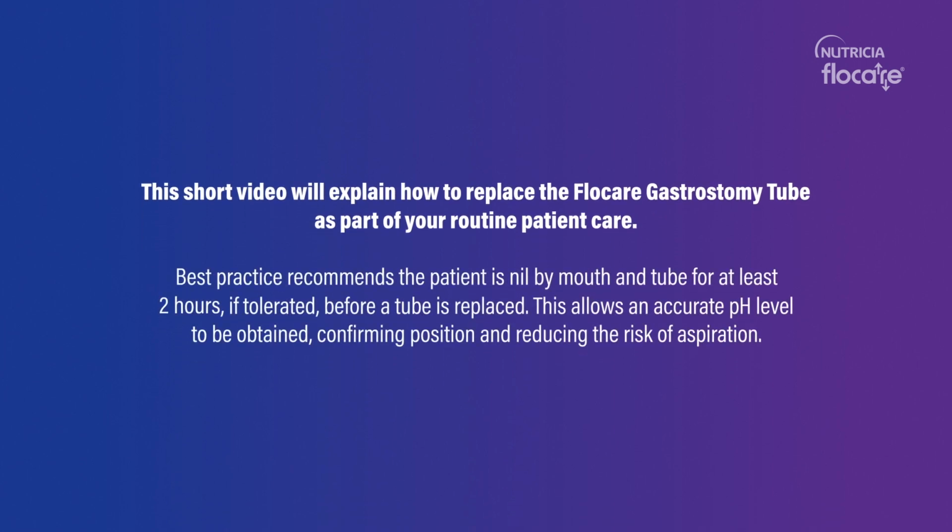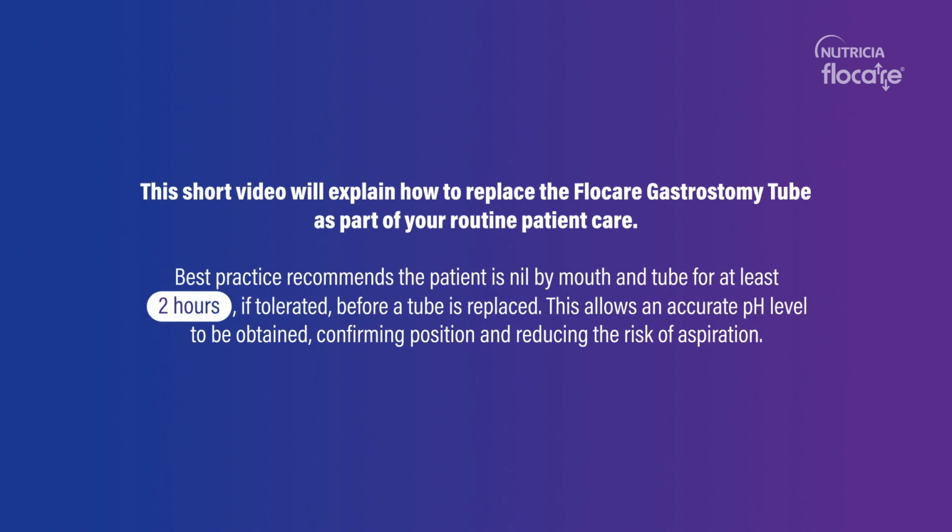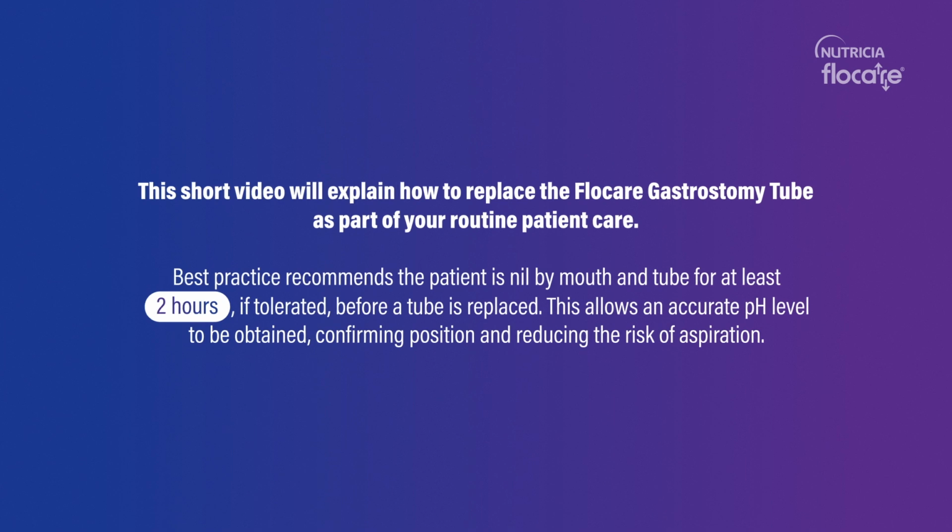Best practice recommends the patient is nil by mouth and tube feed for at least 2 hours, if tolerated, before a tube is replaced. This allows an accurate pH level to be obtained, confirming position and reducing the risk of aspiration.